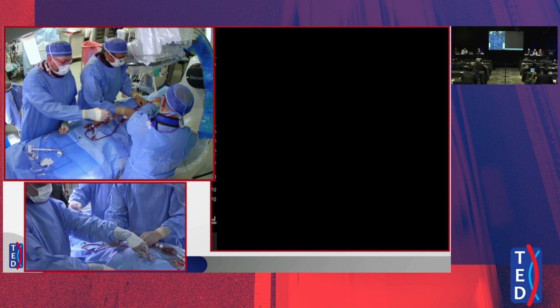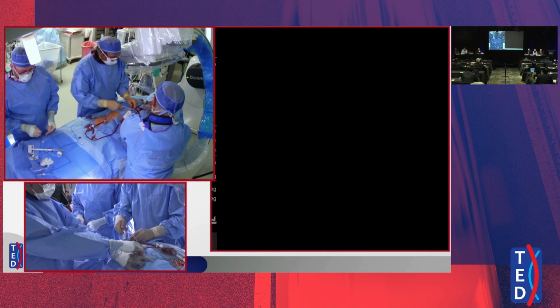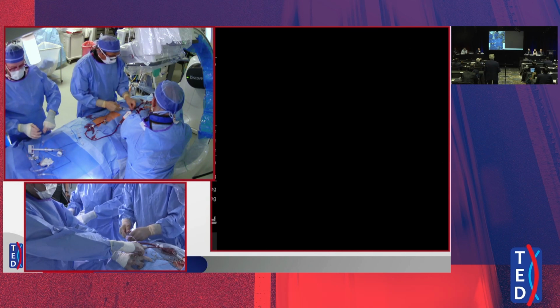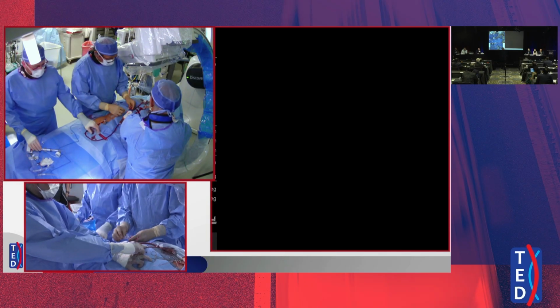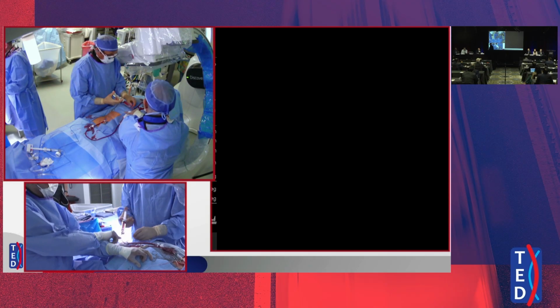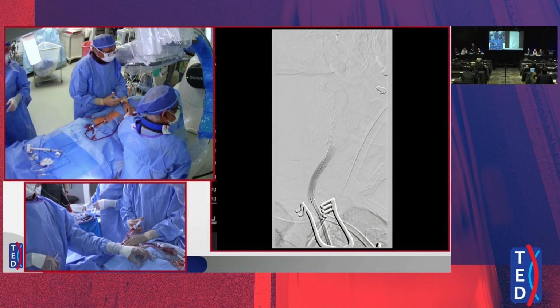Okay, so on CT scan, the common carotid measures approximately 8.2. The internal carotid measures close to 5 or 5.2. You got some contrast? Let's take a good picture of this now, same angle. This is post-balloon angioplasty. Okay, you ready? Shooting. He moved. Do it again, please.